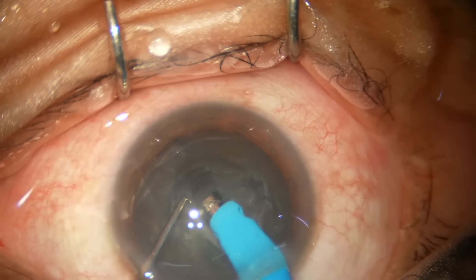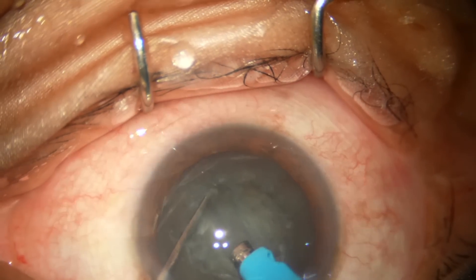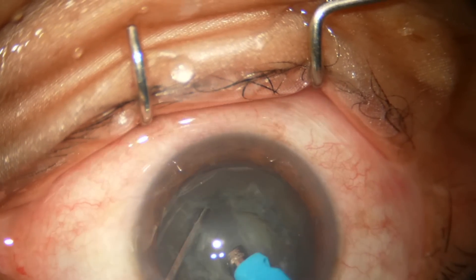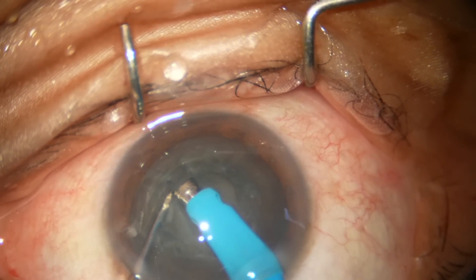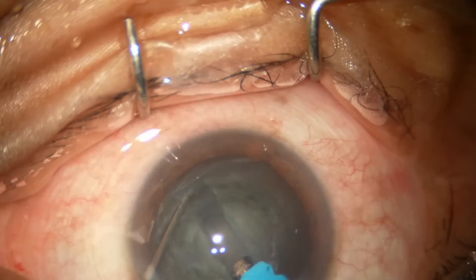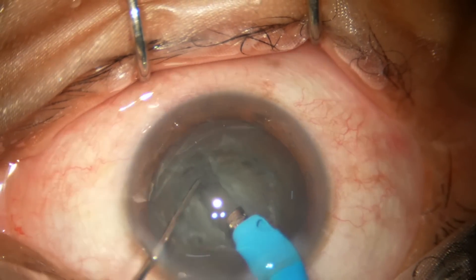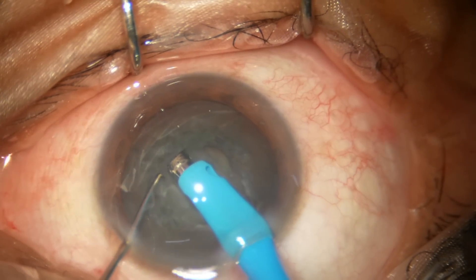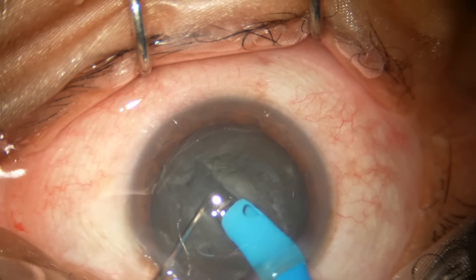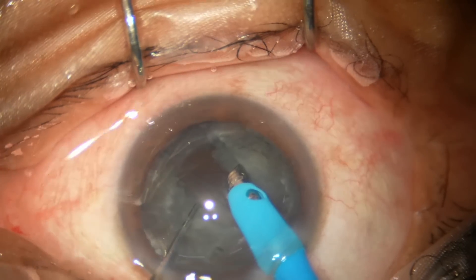Here I should not go deep — I have to come upward from here, rotate it, then go to the other side. A little more at the center part. Now I can see a faint red glow at the bottom of the trench, so this is the time to separate — go to the floor of this trench and separate it.